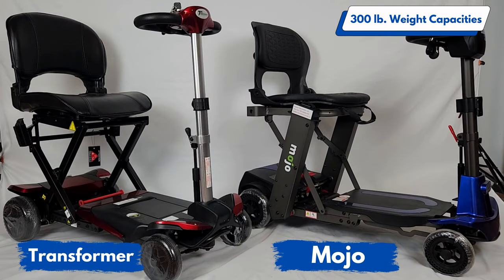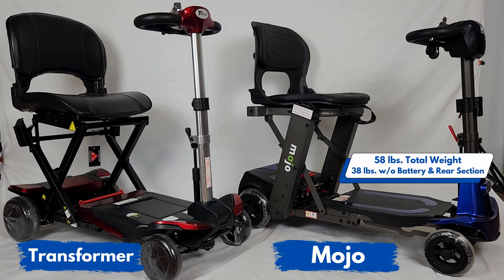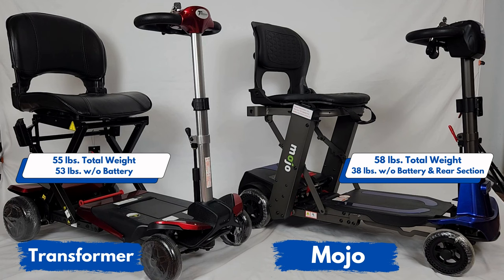The Enhanced Mobility Transformer and Mojo scooter are both automatic folding scooters. With the touch of a button you can easily fold these up into very compact sizes. The main difference is the Mojo will come apart into two pieces, making the front section a lot lighter than the entire weight of the Transformer. The Transformer weighs 55 pounds total, while the Mojo when separated has a heaviest piece of only 38 pounds.